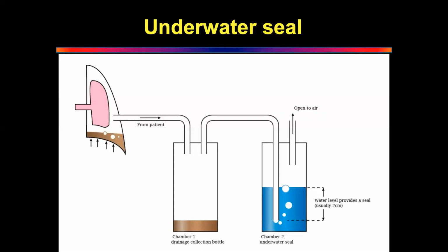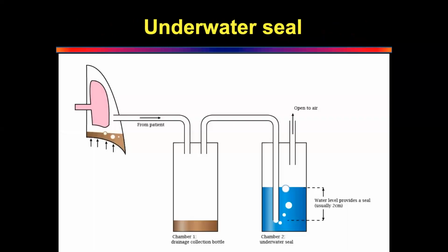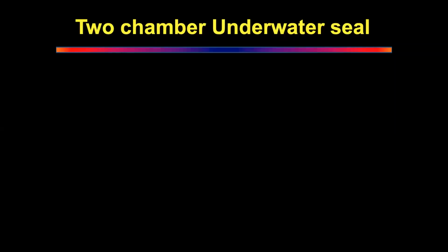What is the problem of attaching a suction in this? Is it effective? You can attach. I agree with you. It's less effective. But the effectiveness is less. Yeah, it won't be effective. Less volume of air, less effective. Yes, first chamber. Okay, so let me just go through it.